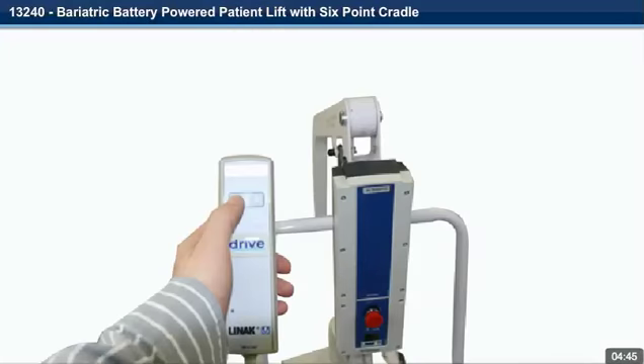Step 28. To operate the lift, use the up and down arrow on the hand control.